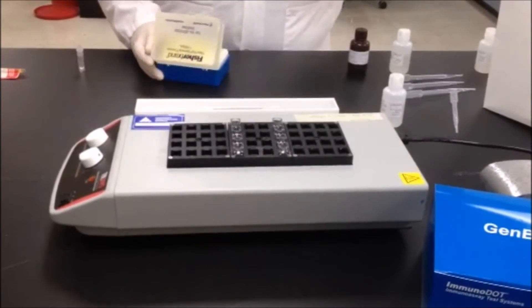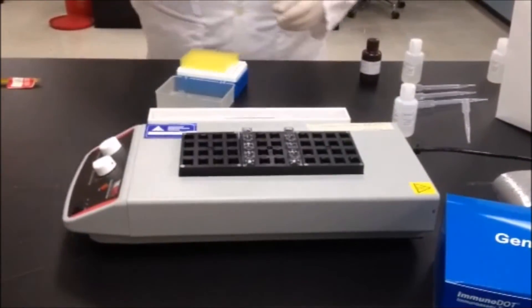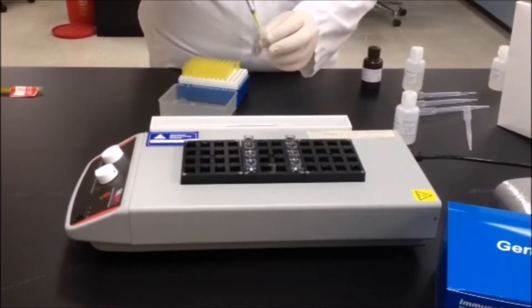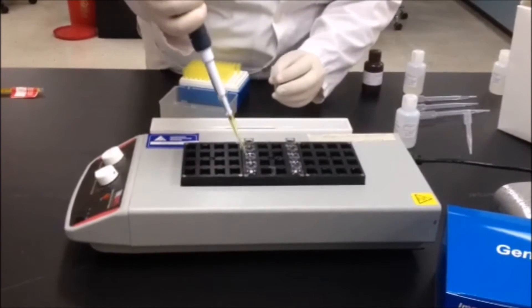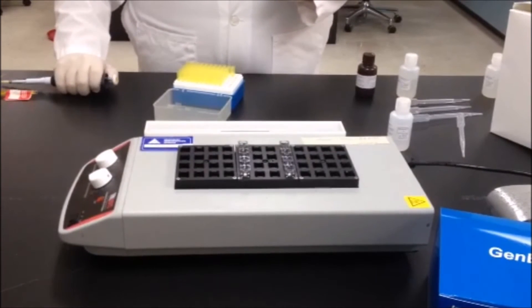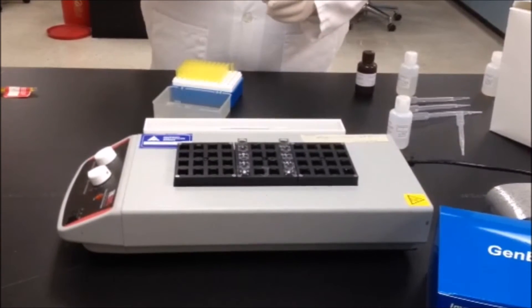The next step is to add the patient specimen. Add 10 microliters of each patient serum to the diluent reagent one in reaction vessel number one. This creates the working dilution for the assay.